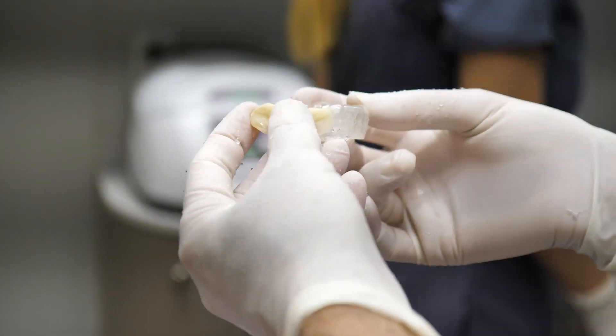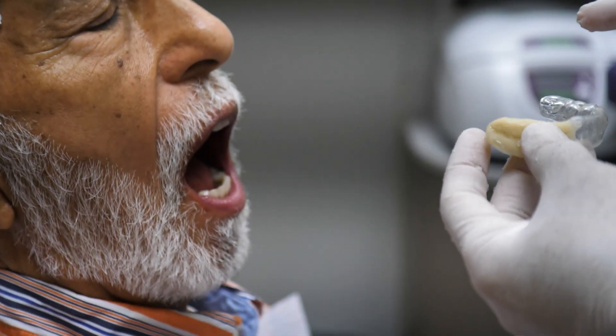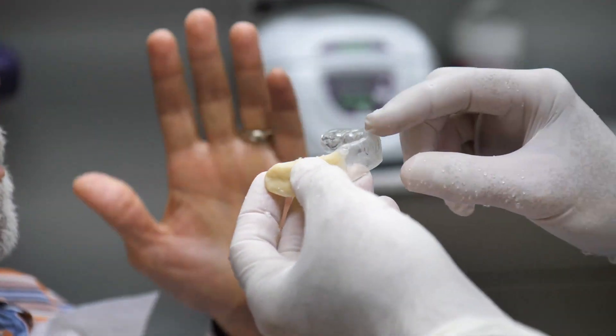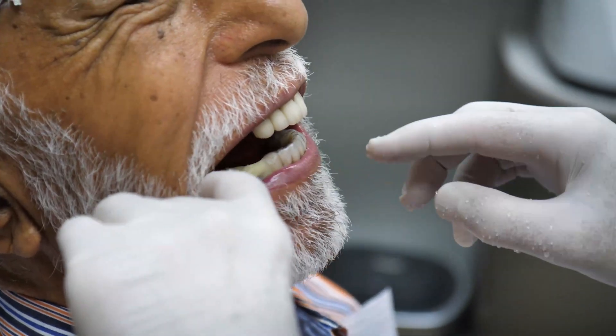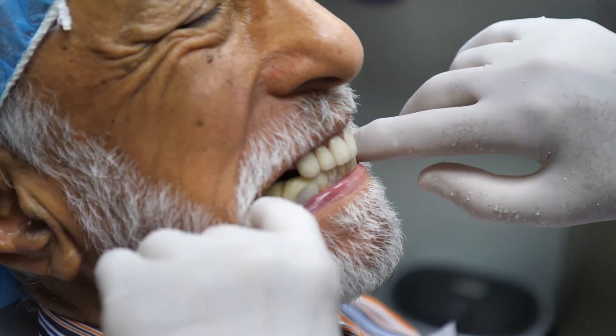So it'll look a little more like a denture but it's not going to touch your upper teeth that much. Okay, so despite this raise, try to chew on this side. I chew on this side anyway, so that's 95 percent. Great. Okay, perfect. Bite down. Yeah — that feels good.